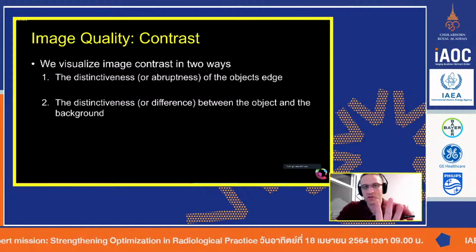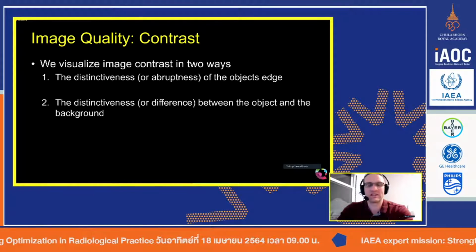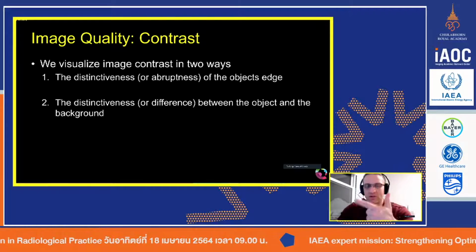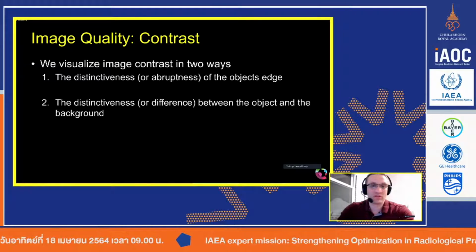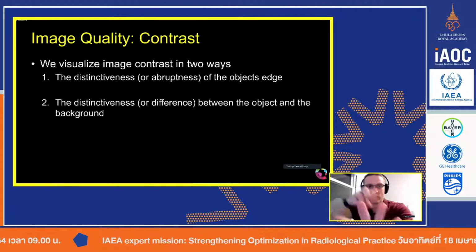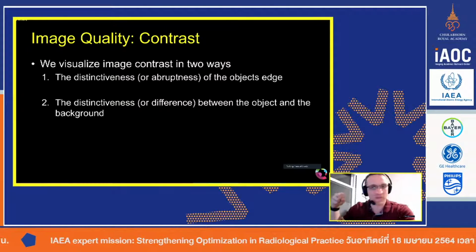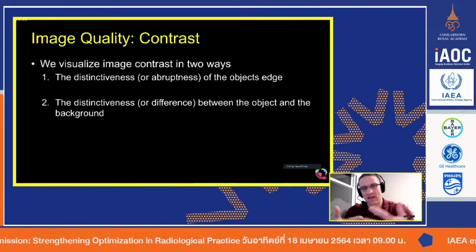But when we were doing this with CT, we talked about the new reconstruction techniques out there, iterative reconstruction and deep learning, and how a lot of radiologists have struggled with these new techniques because we are getting rid of the noise from the image. We didn't want that noise in the image, and so now we can see the anatomy more clearly.